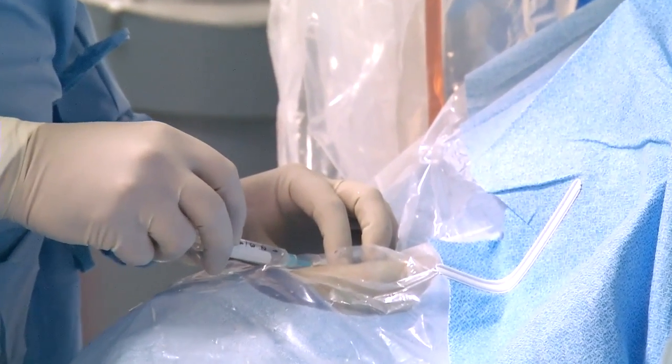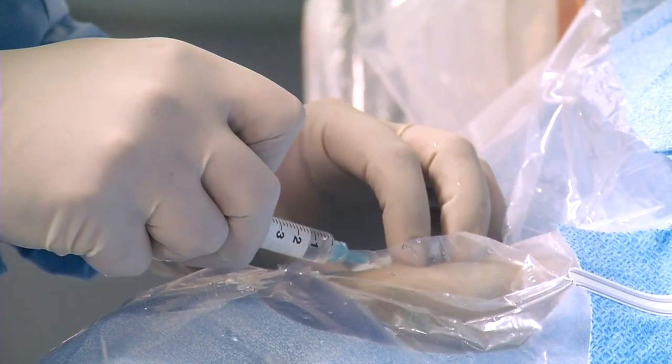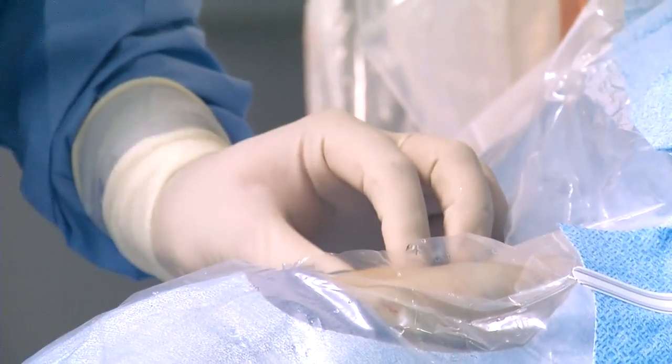So we're going to give a little bit of lido. You're going to feel a little pinch and a burn. Now you only want to give about 1 cc, because if you give too much lidocaine, you could obscure the pulse.